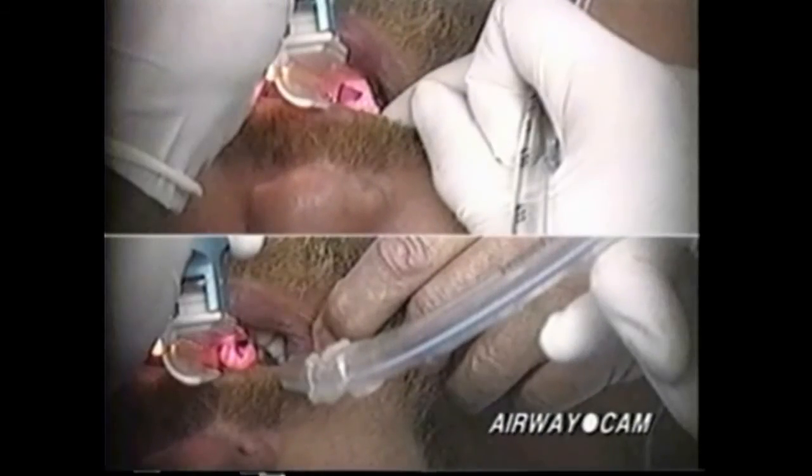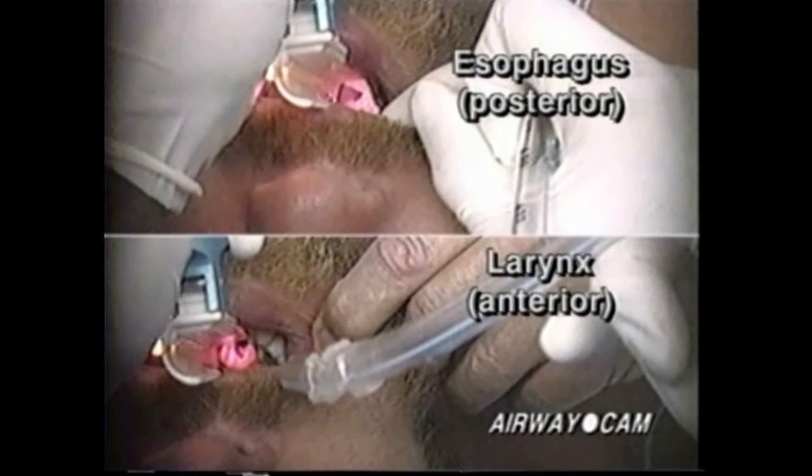This still shot provides a comparison look of the esophagus and the larynx. The entrance into the esophagus, pictured in the upper half of the screen, is a very round hole without structure. It is located posterior to the larynx and slightly to the right of midline. The laryngeal inlet, shown below, has a three-dimensional appearance created by the posterior cartilages, interarytenoid notch, and the aryepiglottic folds. As already discussed, the true vocal cords are often not well visualized during direct laryngoscopy. Recognition of the posterior cartilages adjacent to the glottic opening is a consistently dependable landmark for identification of the entrance into the larynx.